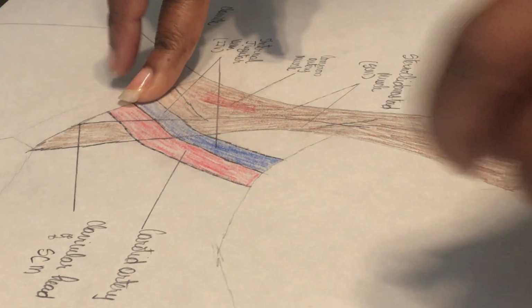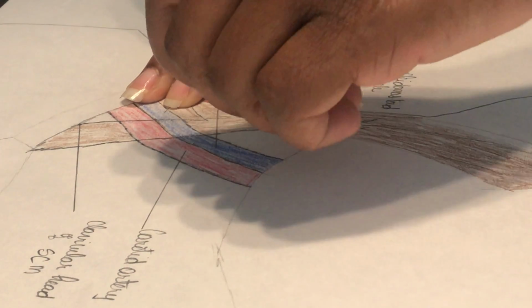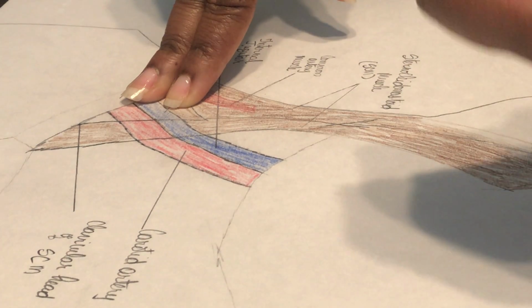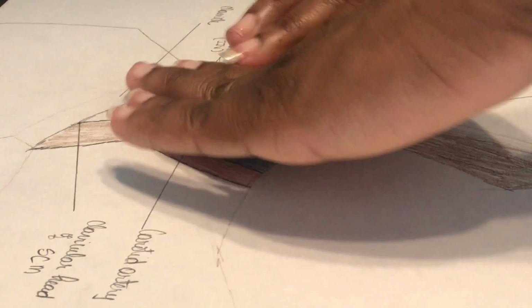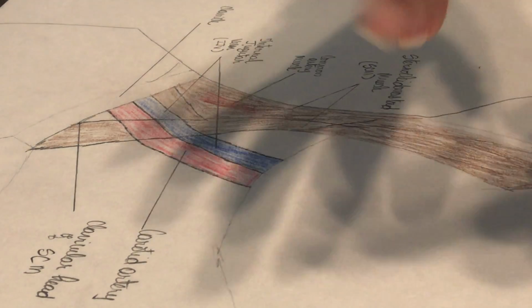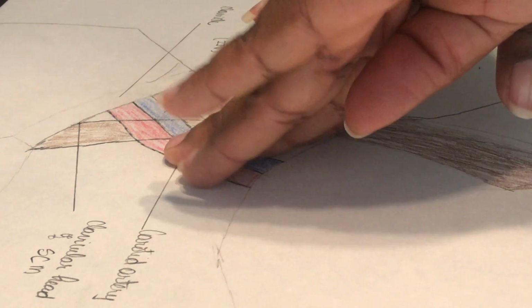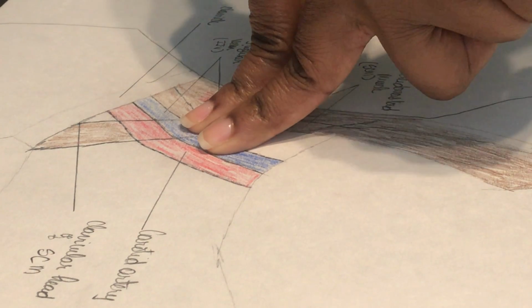Once it's in, I take my saline syringe. Before I flush through the brown lumen, I make sure I aspirate to make sure I have good blood return, and then I can flush, and then I secure my line to the skin with the clear Tegaderm, and then I unclamp each of my lumens. I flush them, aspirate for blood return, and then flush, and then now I can suture my line to the patient's skin to prevent it from dislodging.